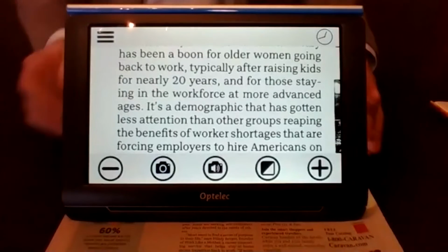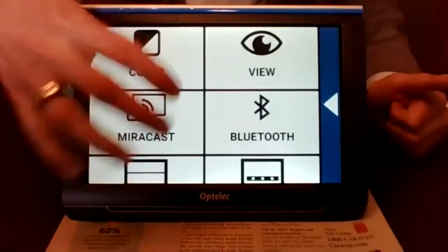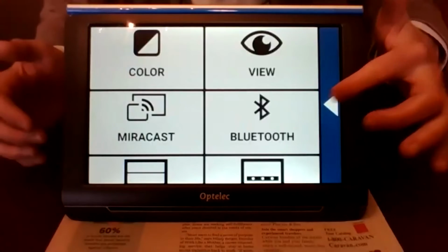Sorry, Mike. Yeah, and that's the other thing. I like the fact that they're all such large icons too. So you've got pretty self-explanatory, but they're large.